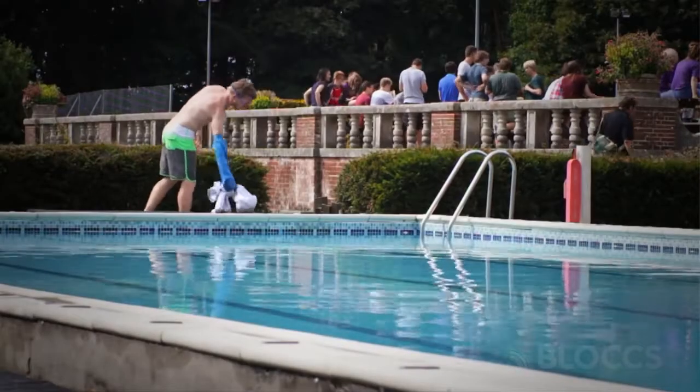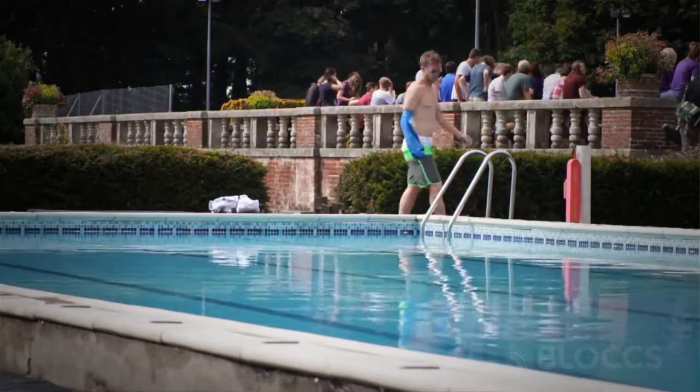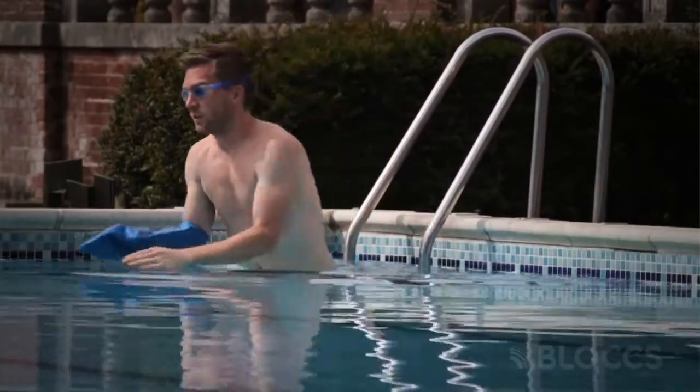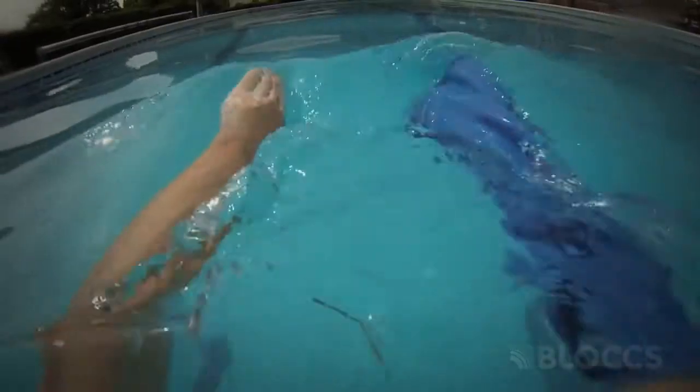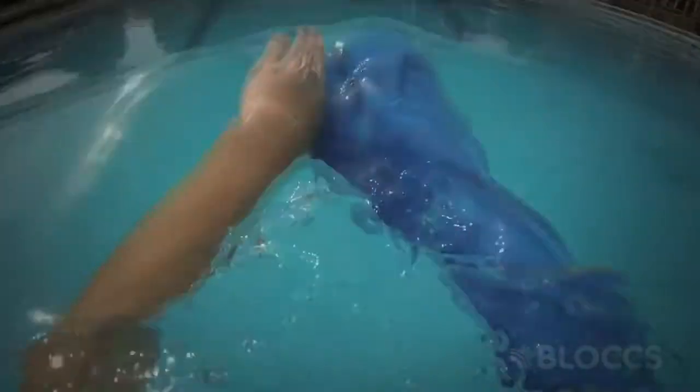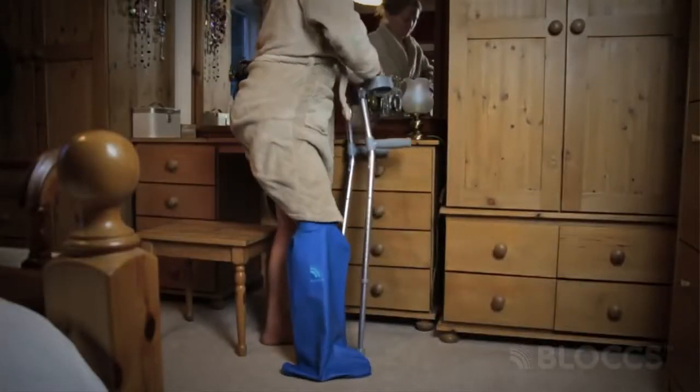One of the key advantages of Bloccs over its competitors is that it's completely submergible. It's an ideal solution so you can continue to train in the pool if you've got a sports injury. Whoever you are, you can wash and continue day to day life as normal.